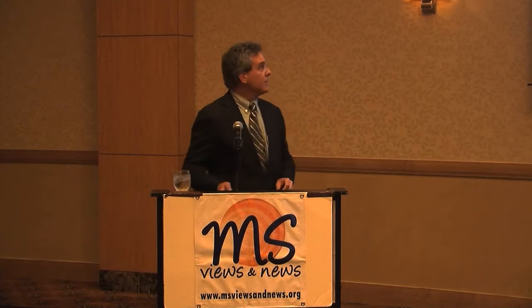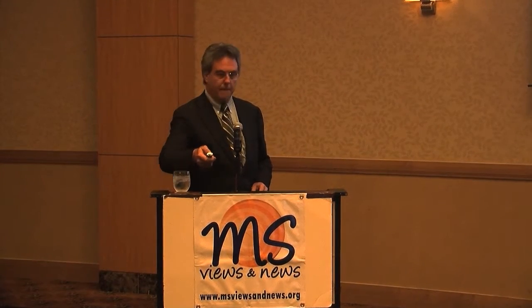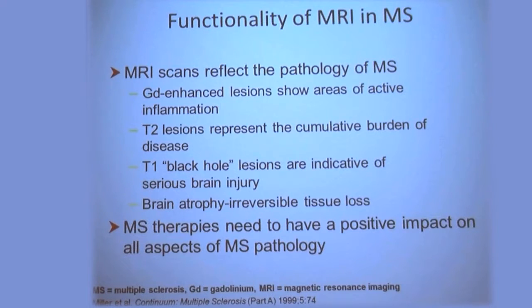All right, so we'll start with MRI, and clinical utilization of MRI. MRIs are really very important, not only in the diagnosis, but the management of multiple sclerosis. It's one of the best, what we call surrogate markers that we have in terms of evaluating somebody to see if they have multiple sclerosis and to identify those who are progressing in the disease.